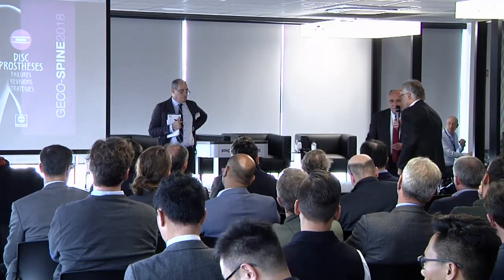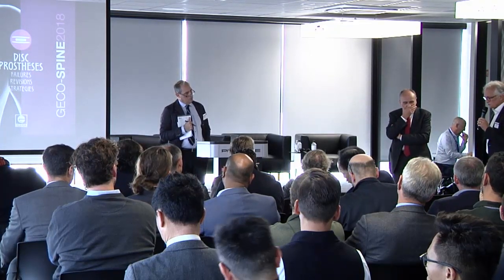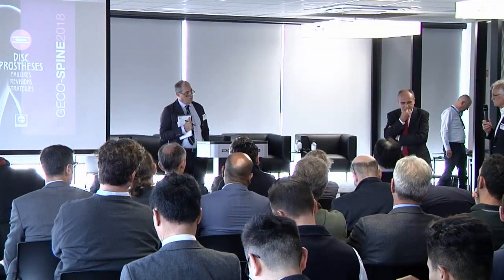Maybe I can give you some comment. There was a lecture from Punjabi two years ago at the ISS Congress, and he showed similar cases with the changes of the center of rotation in the cervical spine, and he made a very interesting statement that only a prosthesis with six degrees of freedom is able to compensate the different centers of rotation of a cervical spine. So that's what I meant. It was an interesting statement without any reference to a different prosthesis, but it has to be a viscoelastic prosthesis that is able to do it.